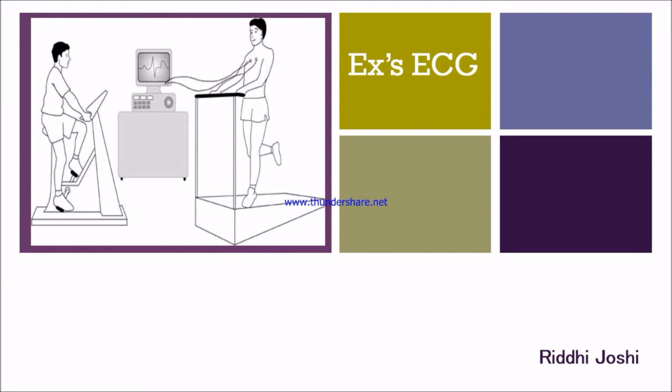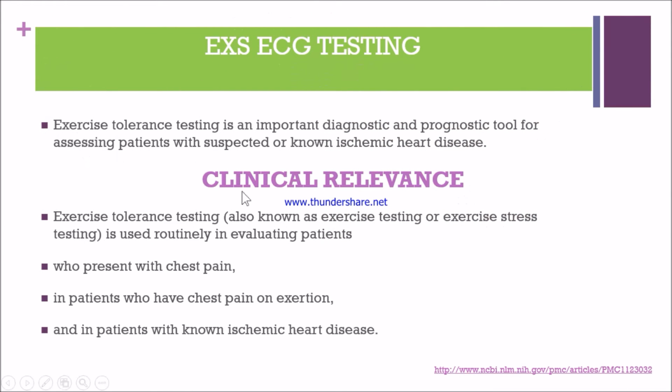So what is exercise ECG testing? Let's see it. So we are going to see about the exercise ECG testing. So what is exercise ECG testing? It's also known as exercise tolerance test. It's an important diagnostic and prognostic tool for assessment of patients with cardiac disease, ischemic heart disease, etc.